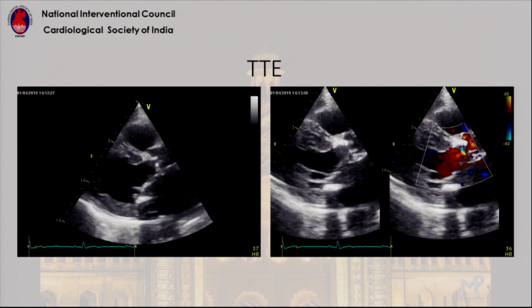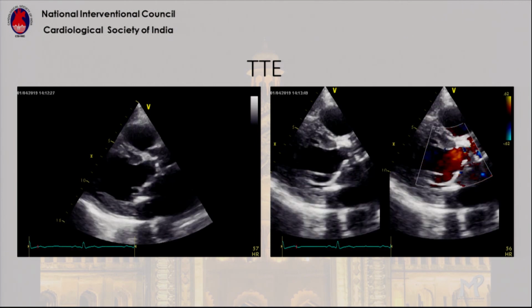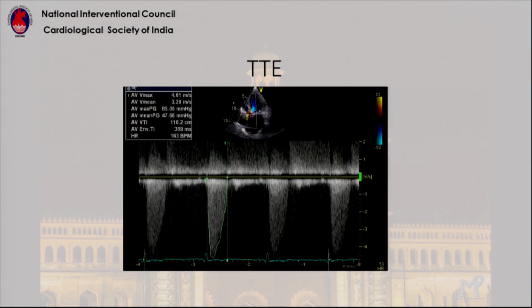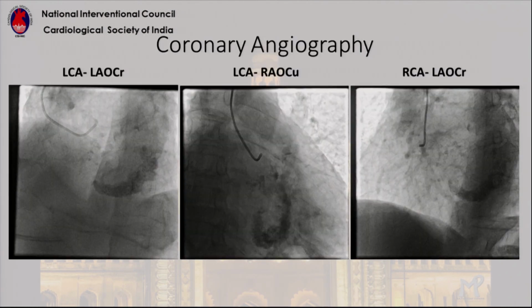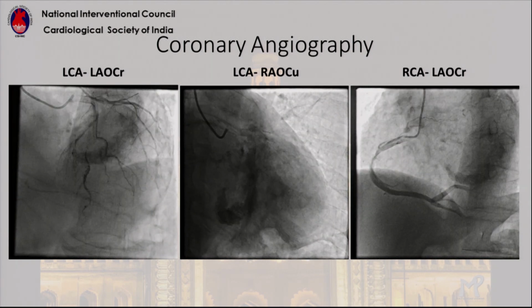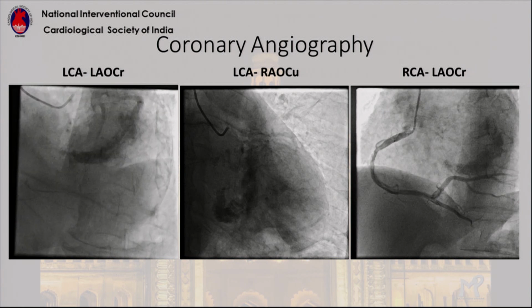So that's the echo you see. He has aortic valve calcification and it's severe aortic stenosis. You see some leak there, and there is a heavy mitral annular calcification. You can see on the posterior end of the mitral valve, there's MAC in there. Next, please. That's the gradient shown. Next, please. So that's the amount of MAC. You see, there's very heavy MAC actually. The coronaries are okay.